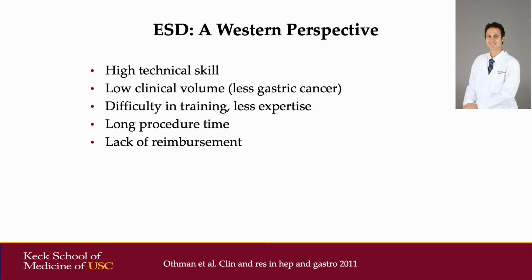From a Western perspective, in terms of ESD, we know that ESD takes a high level of technical skill. It is challenging because of the lower volume of gastric cancer. Often in the West, ESD training is started in the rectum. It is difficult to train as there's less expertise in the Western world as there is in Asia, although that is now changing and we do see much more expertise.